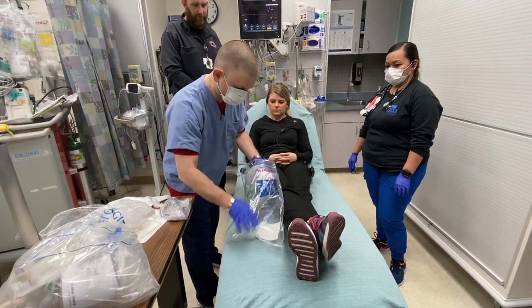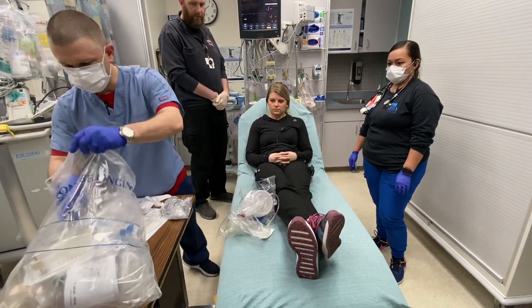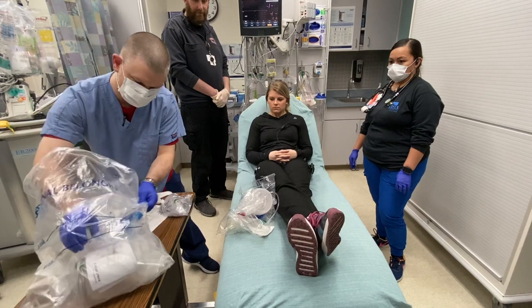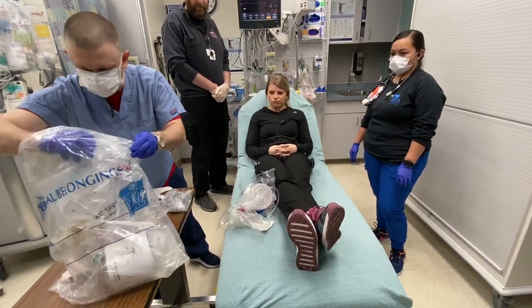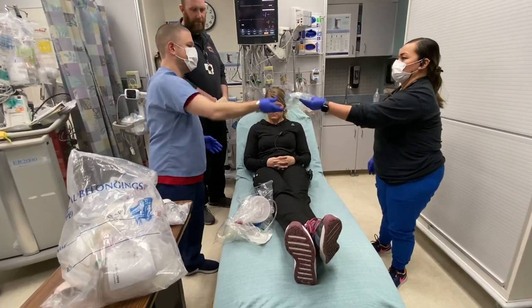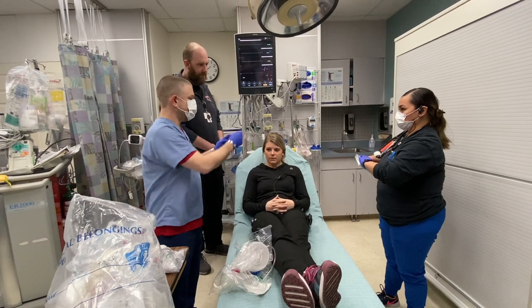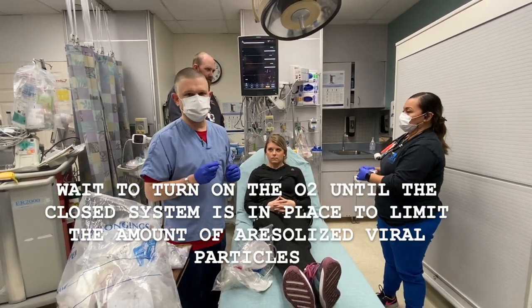The first thing you want to do when you come into the room is have your nasal cannula ready, and I will hand the nasal cannula over to the nurse. She's going to open that, hook it up to the oxygen tree, and put it on the patient without turning on the oxygen yet.